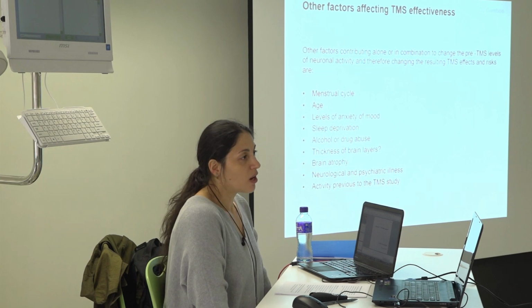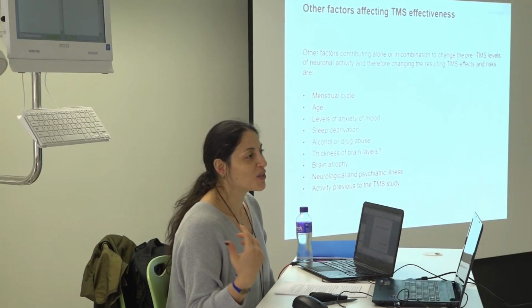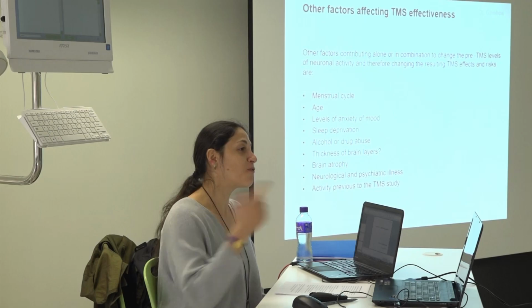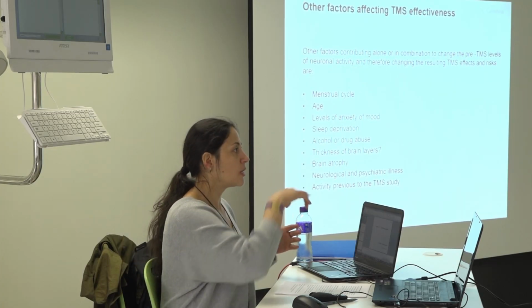Age is important. Now we know that TMS interaction is different with age. Levels of anxiety or the mood. When the person comes angry or something, you do have a different MEP reading. I can tell you that. In the beginning, when I started working with this, I remember that one of my mentors told me, if the person is angry, if you fought with your mother, you will see it in the MEPs, and you do see it. Like you have these big peaks or this kind of thing. You do see that, and if they are tired, you see it. If they are falling asleep, you see it. You are in the back part, but you see it in the EMG. It's very clear.